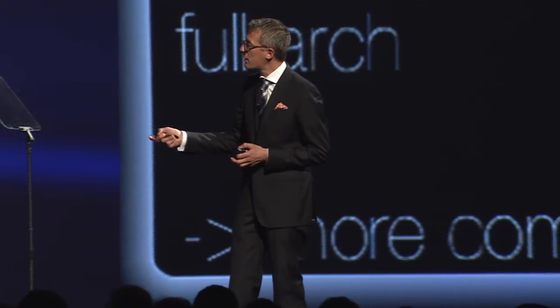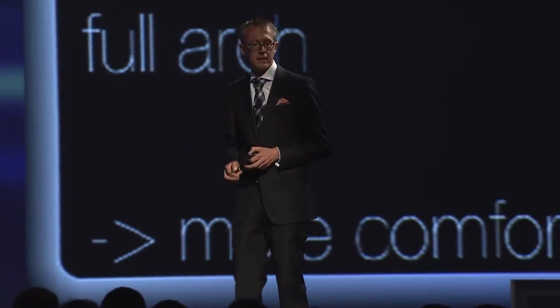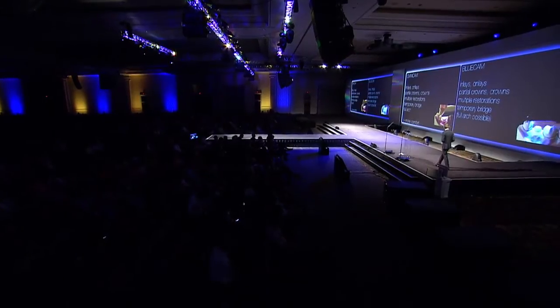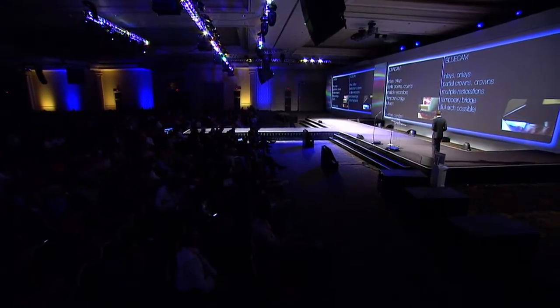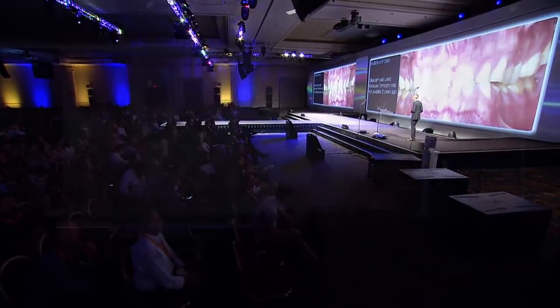So you can go around the complete dental arch in order to scan it. And you saw a complete arch scanned with the OmniCam in Sam's presentation, and also Albert Mehl will show a case where we see a complete arch done with the OmniCam camera.